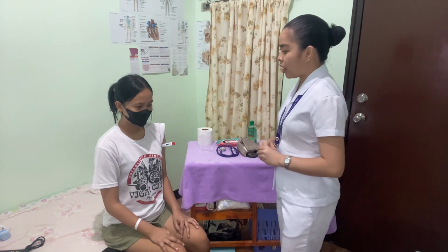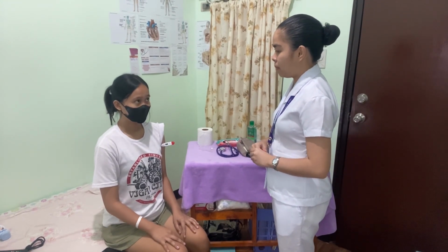Okay, now we just have to wait for a minute or until the thermometer beeps, which indicates that it has already obtained the body temperature of the patient. Ma'am, we just have to wait for the thermometer to beep, okay? After this happens, I need to inform my patient of the result of her temperature, disinfect the thermometer, and perform hand hygiene. I'm also going to document the data that I have gathered.